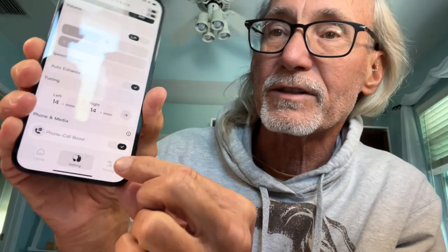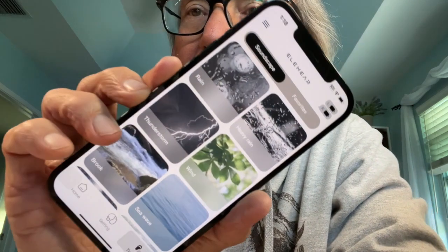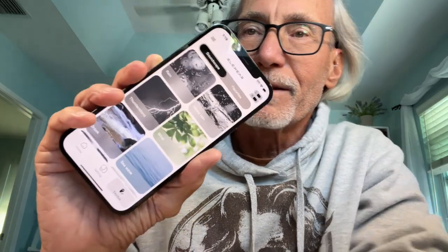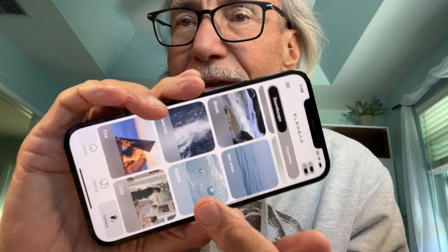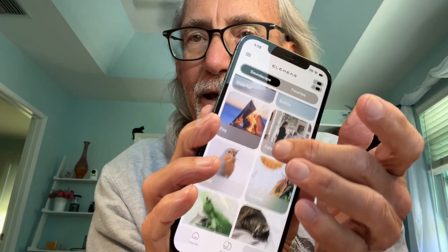All right, so if you have tinnitus, where you like ringing in the ears, you can press this. And then it gives you these different situations that you're in, or not in, but you can pick. All right, so there's soundscapes and your favorites. You can do rain, you can do heavy rain, thunderstorm, wind. I mean, look at them. There's a whole bunch of them. So if you read what they're saying there, that's what you're going to get, okay? You see that?